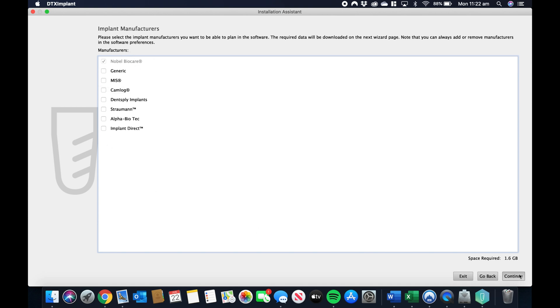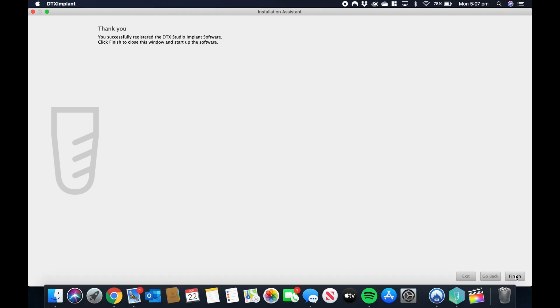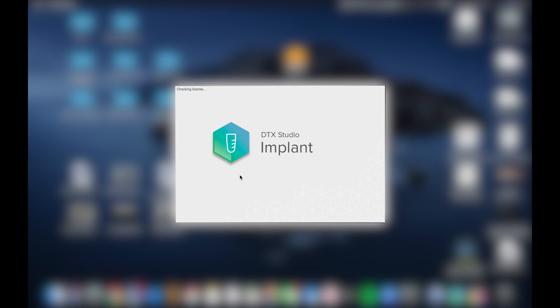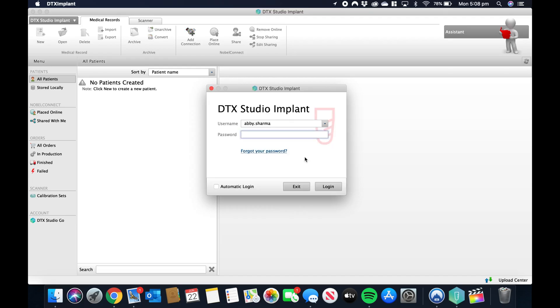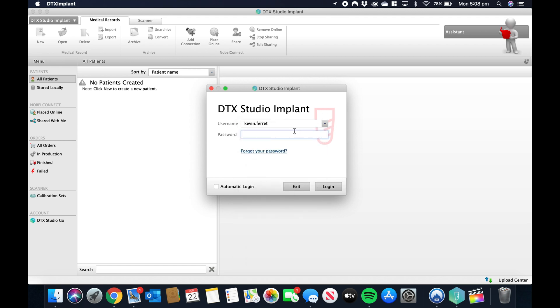And once the software starts, you're going to need to enter your credentials again, which is your first name dot last name plus your password. Tick the automatic login so you don't need to enter your password every single time you go into the software.